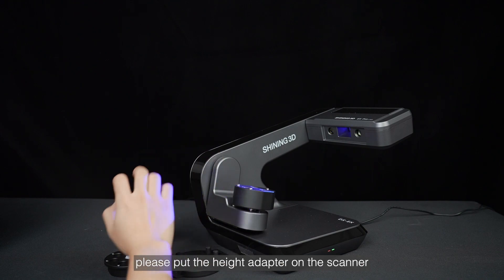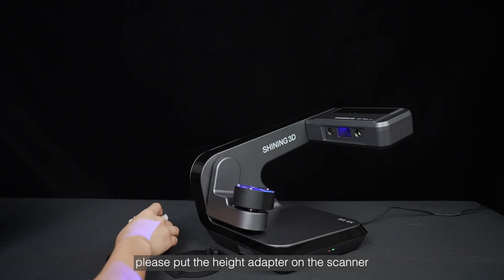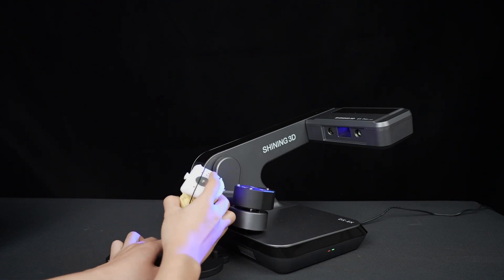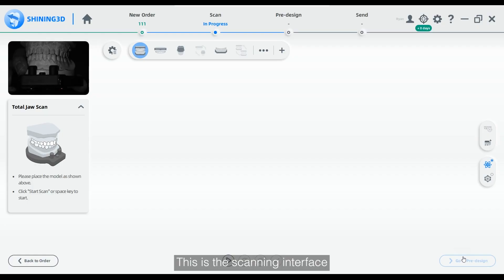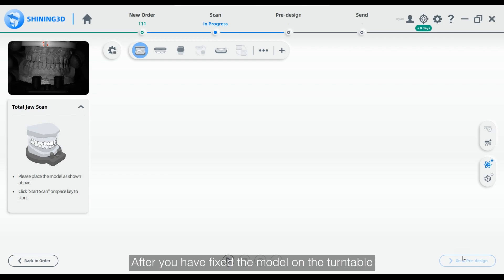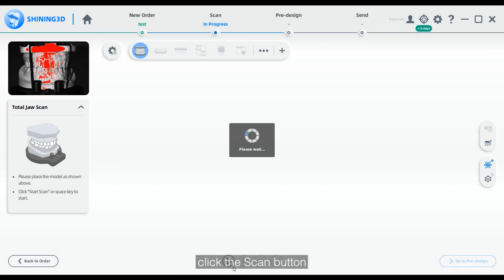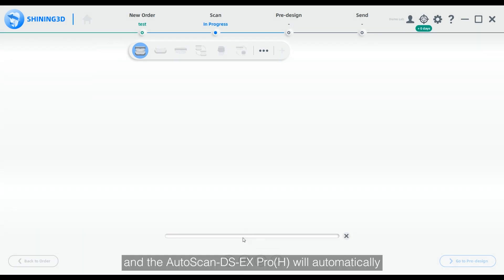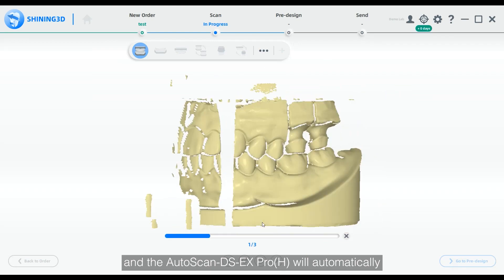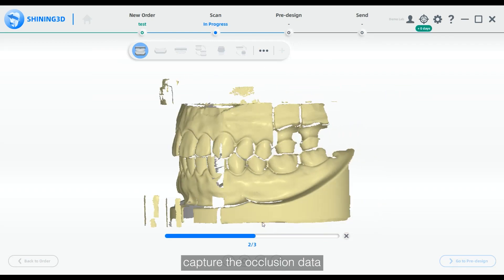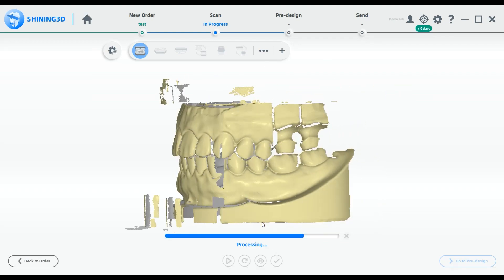Before scanning, please put the height adapter on the scanner. This is the scanning interface. After you have fixed the model on the turntable, click the scan button, and the AutoScan DSX Pro H will automatically capture the occlusion data.